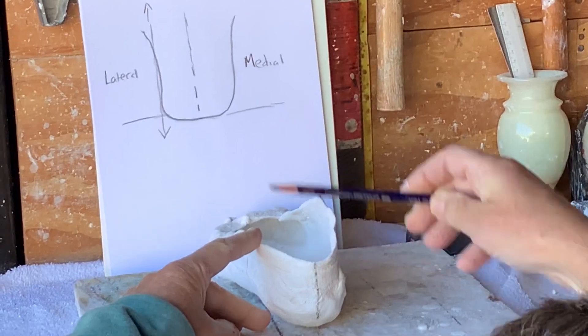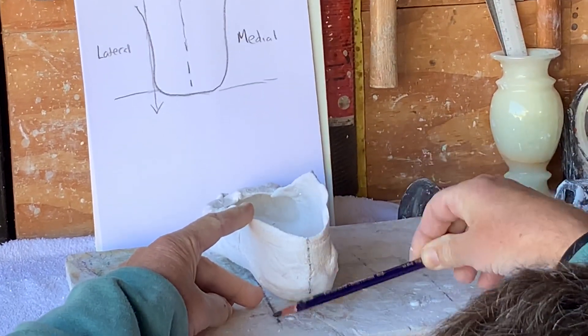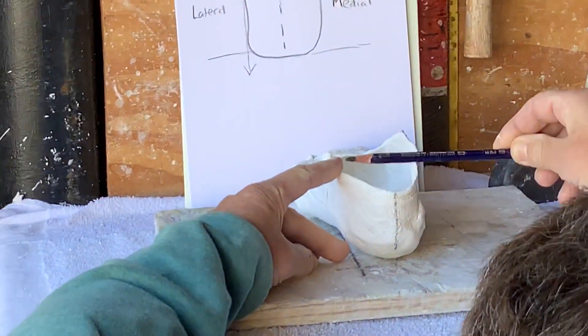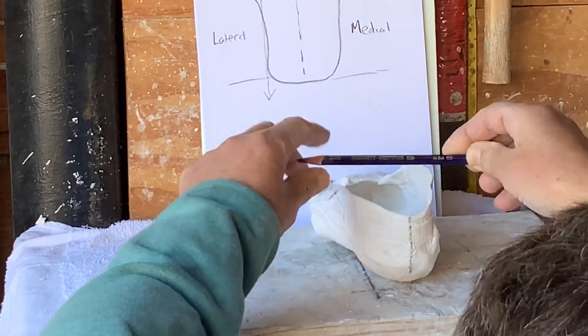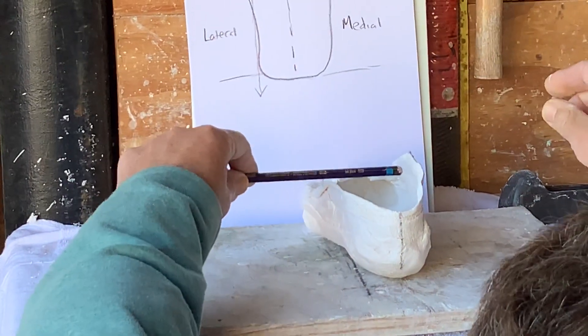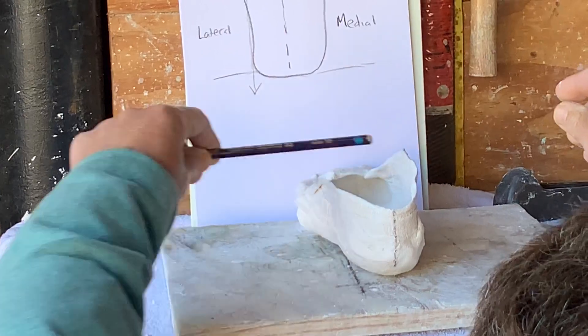That is going to be our new reference point to the ground, so we know when we pour the cast, the cast is going to be, or the top of the cast is going to be perpendicular to that and going to be a representation of the ground.